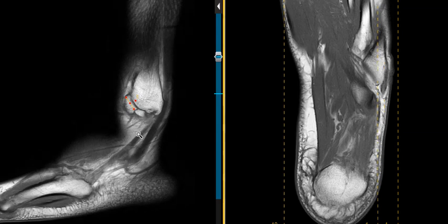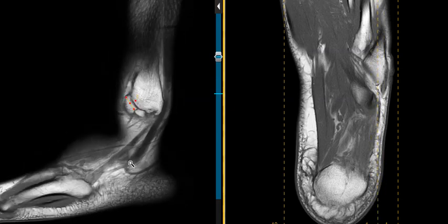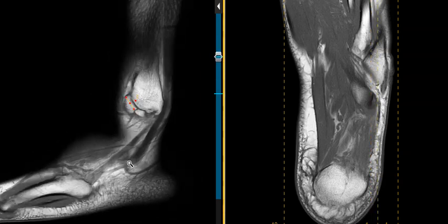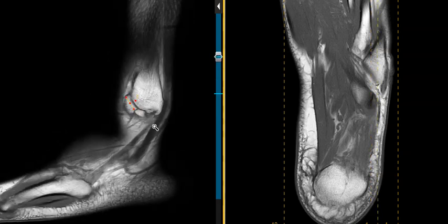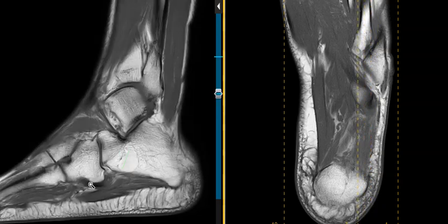Now we see a tendon coming here — this is the peroneus brevis tendon coming down to the base of the fifth metatarsal, and that looks intact. This is the peroneus longus coming down, and it's going to loop below this structure here. We just don't see it down here, which is very common because of what we call magic angle phenomenon. You can also get something called a fibrocartilaginous node in here that will cause the signal to be hyperintense rather than jet black.